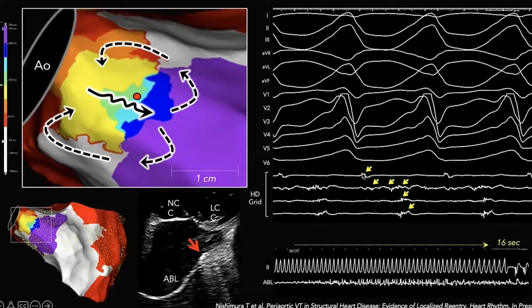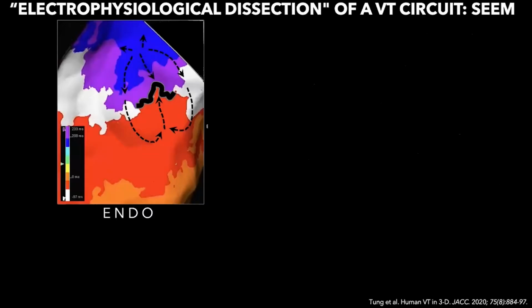Note the first bipole is early systole. Note the third bipole is presystolic. One single bipole is spanning the entirety of diastole. Note also that the noise level is quite low. This was successfully ablated in 16 seconds and terminated with 1 RF lesion. The longer the electrogram, the quicker the time to termination. And that's because it's very, very hyper-localized.